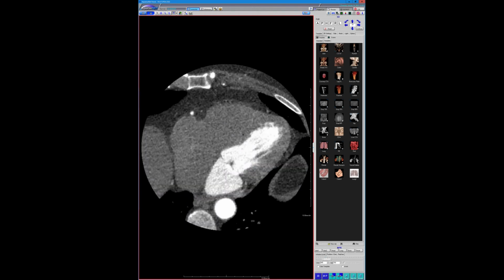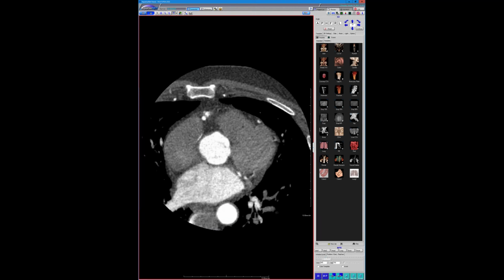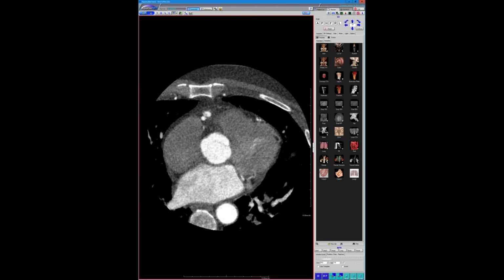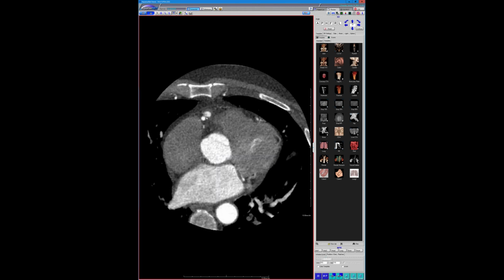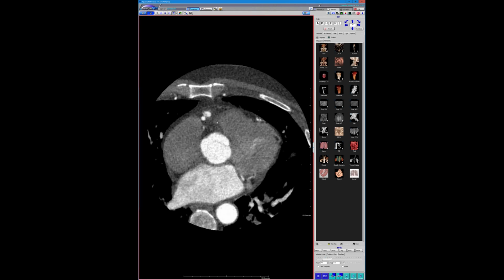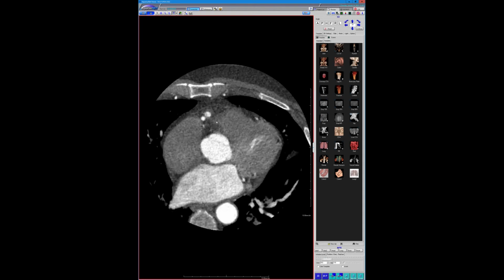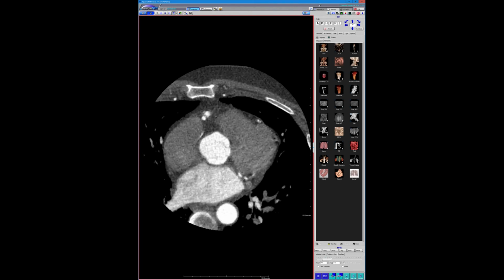Yeah, Jeff, can you put SDHD mutation? That's probably right. Yeah, so I don't know what this is. But funny, the textbooks wouldn't tell us to look for paragangliomas in those particular locations. No, yeah. I mean, I've seen maybe 5 or 6 cardiac paragangliomas.